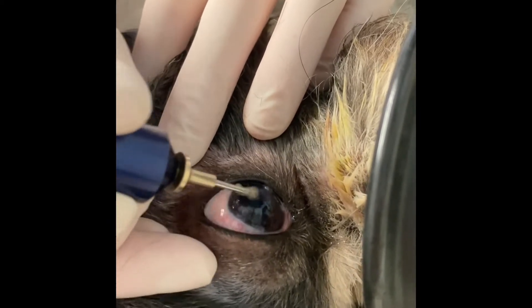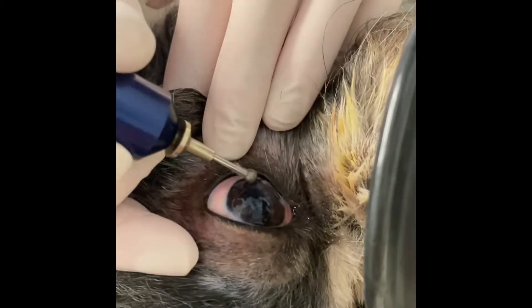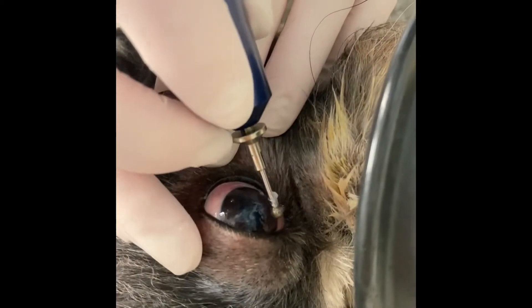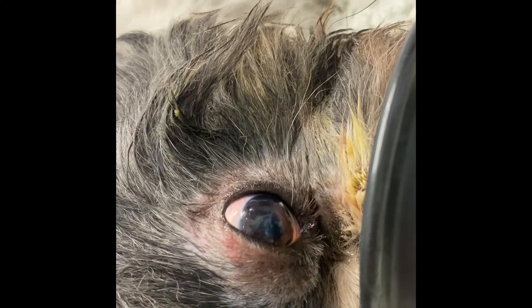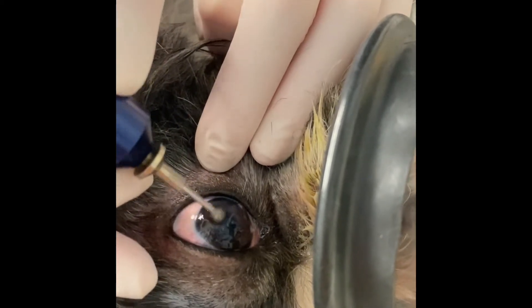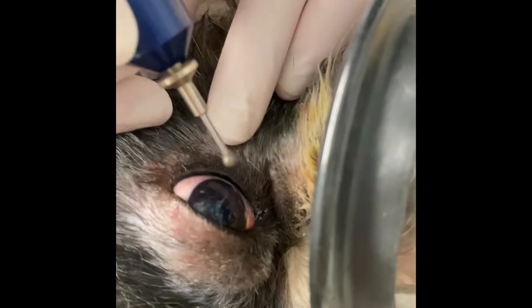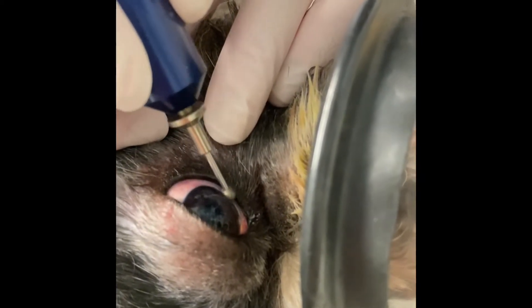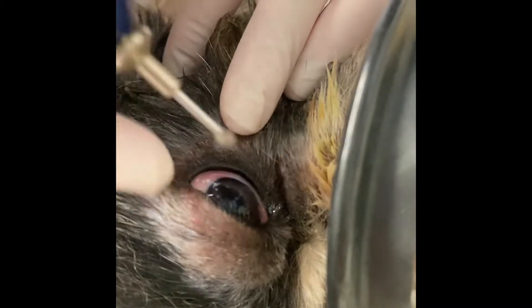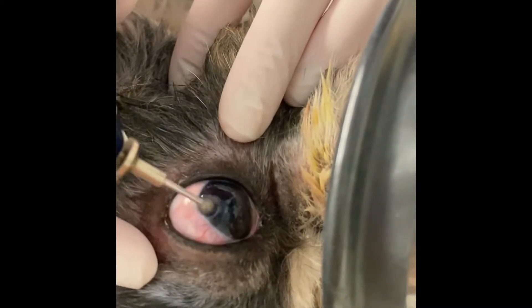You apply the pressure across the entire corneal surface. This can be done either purely under local anaesthetic, or with a little local anaesthetic topically and a light to moderate sedation. I tend to prefer doing mine with sedation because I find it a little bit easier to ensure that I've actually covered the whole of the corneal surface, but there is individual clinician preference here.